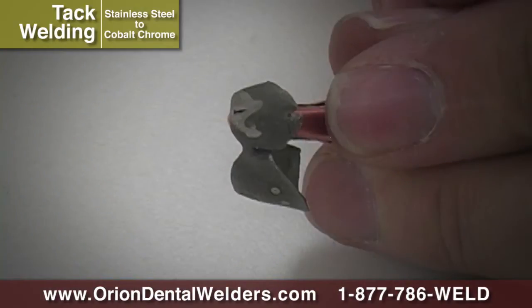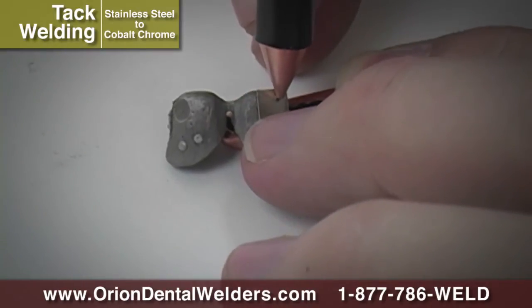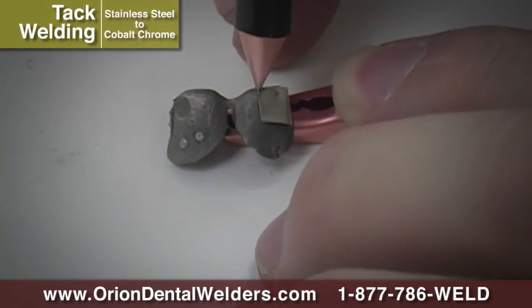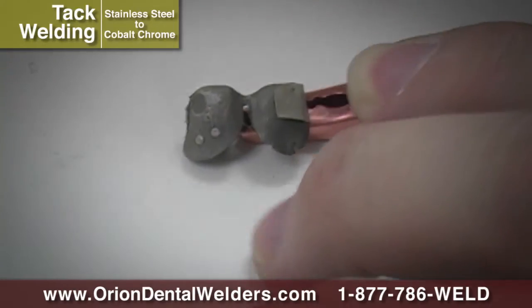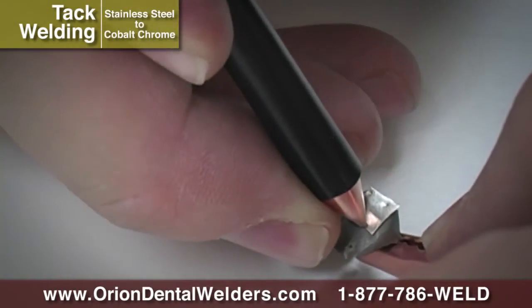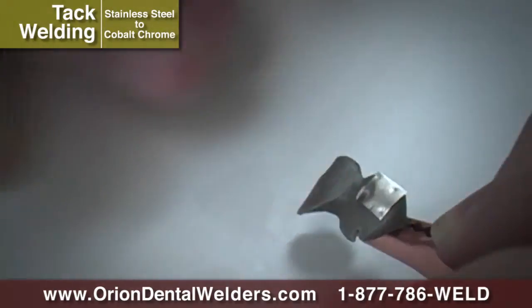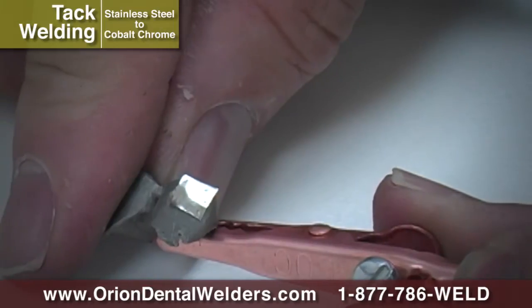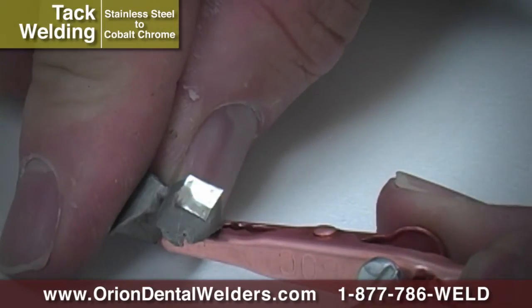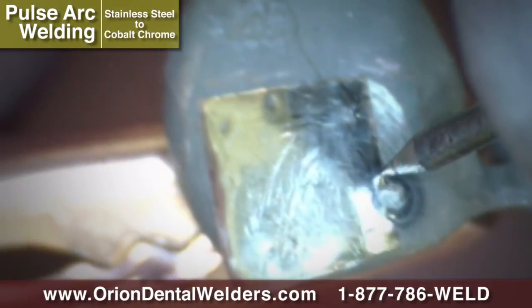A large hole may have walls too thin for Pulse Arc welding. Take a thin foil patch and use the Orion's Spot Mode to resistance weld the patch over the hole. After spot welding, make sure the foil edges have been pressed flush against the underlying surface. Use Micro Pulse Arc Mode to weld the seam around the patch.